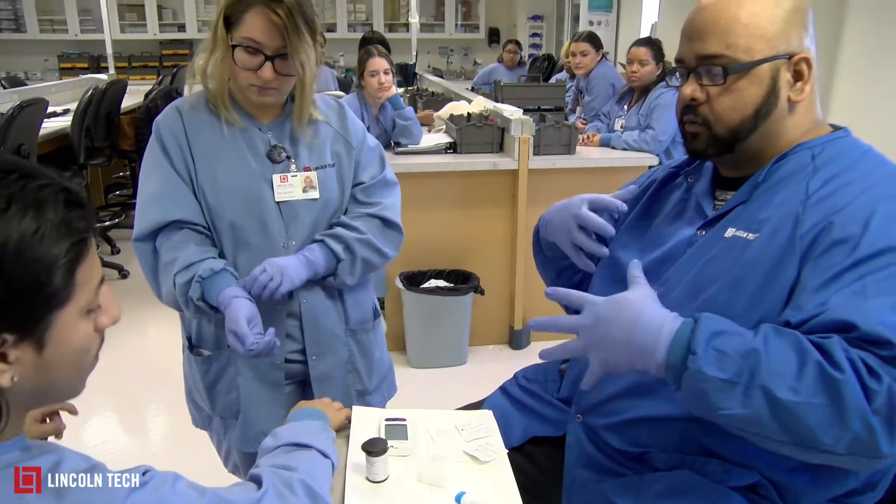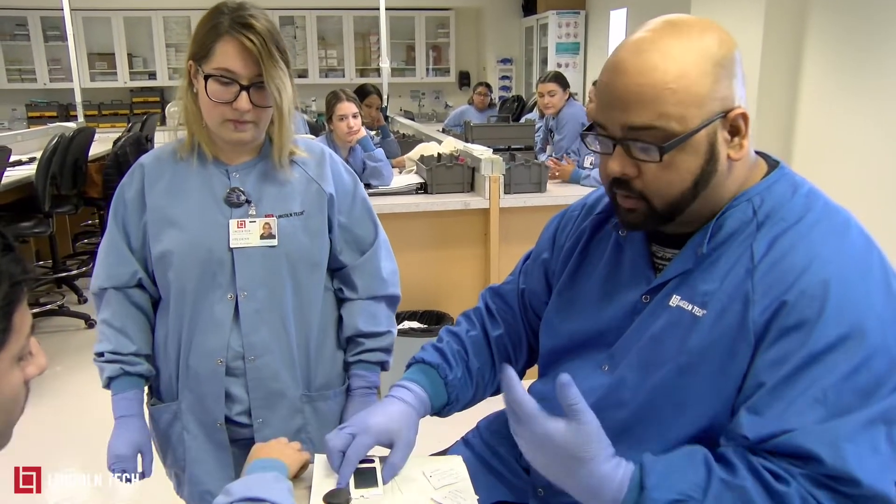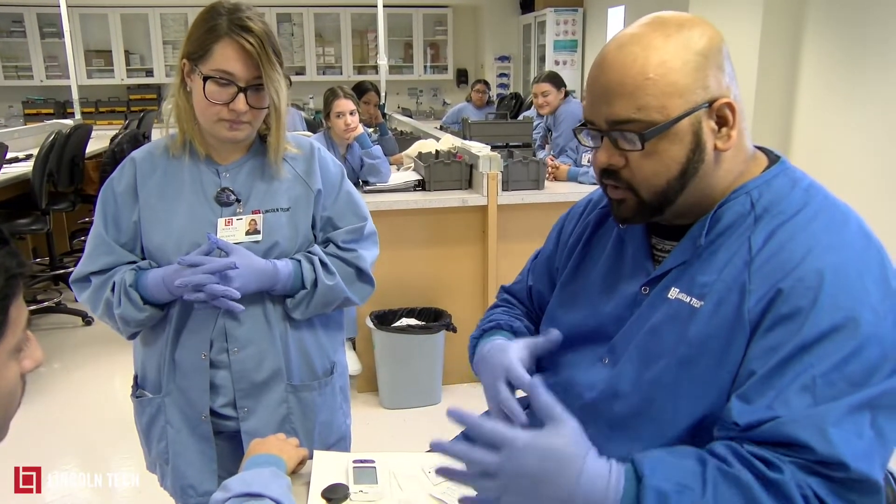Today I'm going to show you how to do a capillary stick, or a glucose stick. It's to check for glucose levels in the blood — sugar levels pretty much. So before you do that, you need to get the equipment.